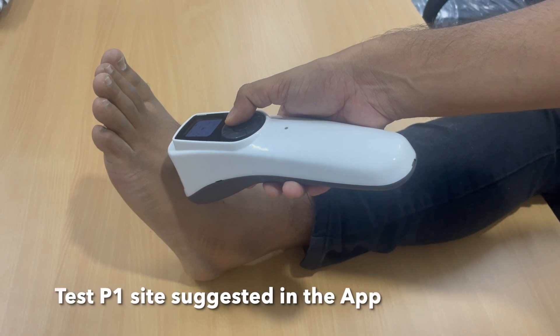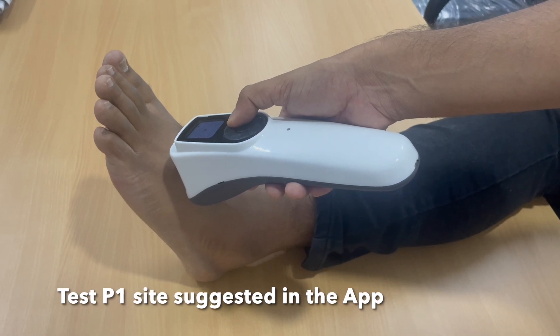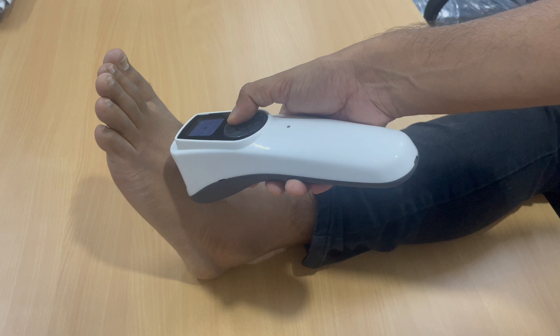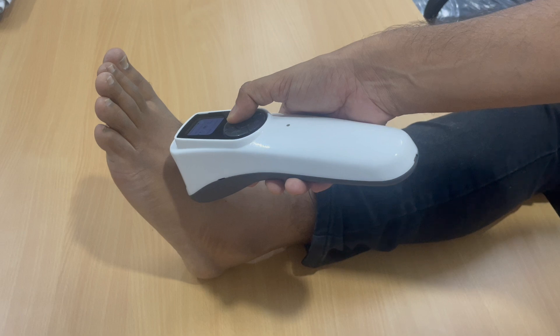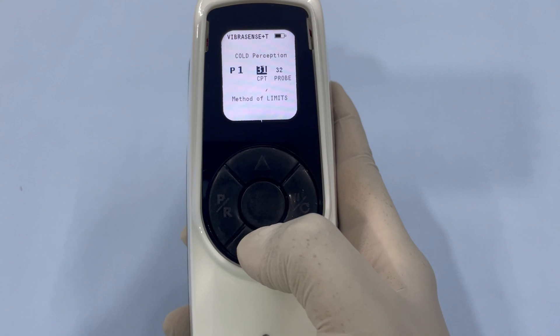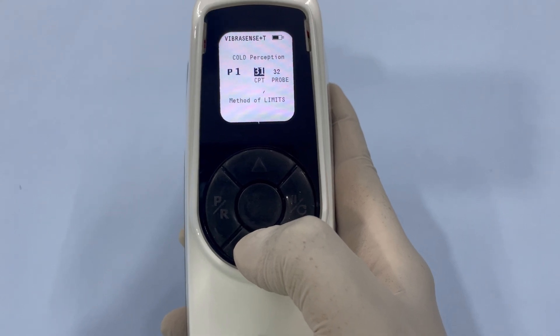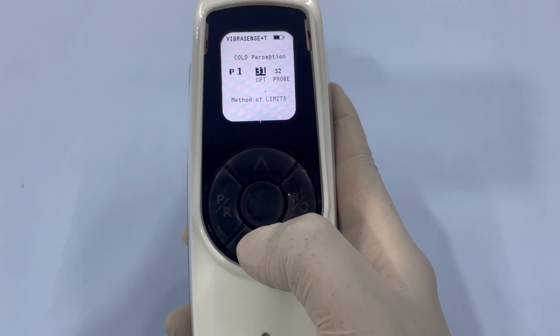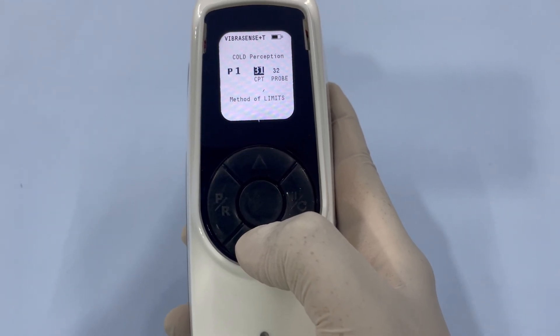Place the probe on the testing point P1. Instruct the subject to indicate when they feel a cold sensation. Gradually reduce the probe temperature using the down arrow until the subject confirms feeling the cold sensation.